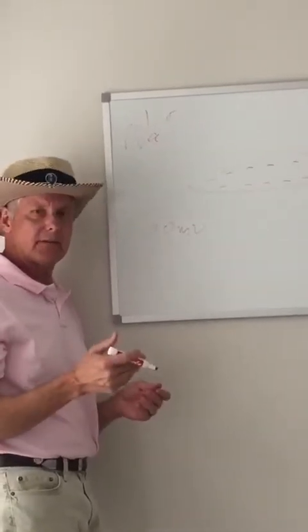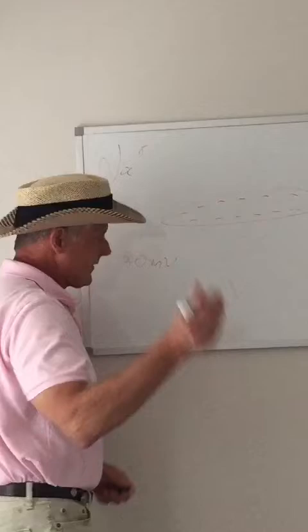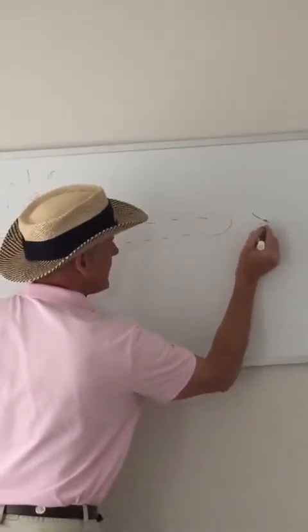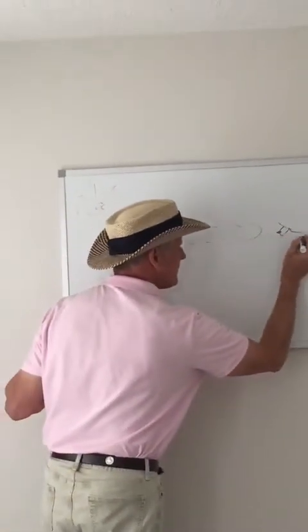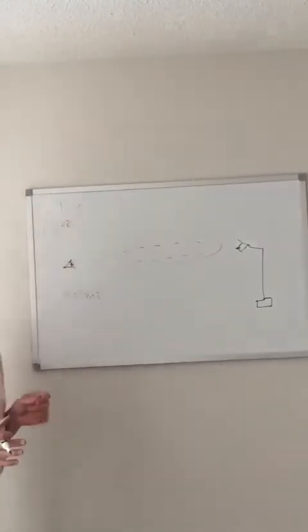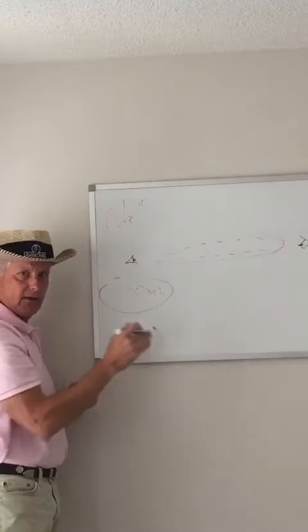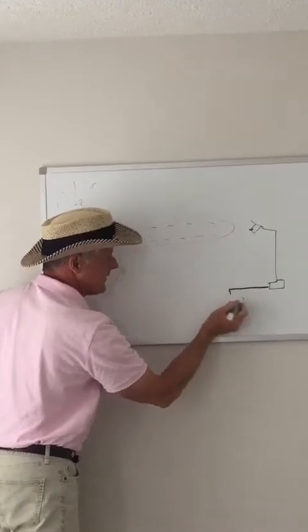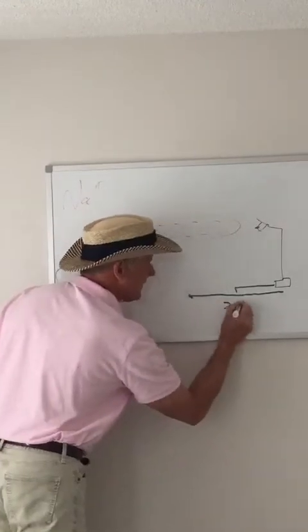So how does that relate to the EKG machine itself? So we have a piece of myocardium over here. And then we're going to have, in this particular case, a person with green eyes. We're going to put an eyeball over here and an eyeball over here, just for starters, okay? All right? And then we are going to hook this eyeball up to a machine, or basically what would be a transducer that can sense the depolarization from minus 90 millivolts during activation, along an axis. It will sense that, and this transducer is hooked up to a stylus. And under that stylus is a piece of paper that's traveling in this direction at a set rate of 25 millimeters per second.